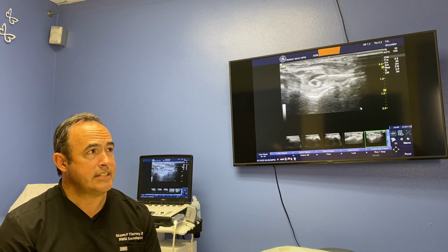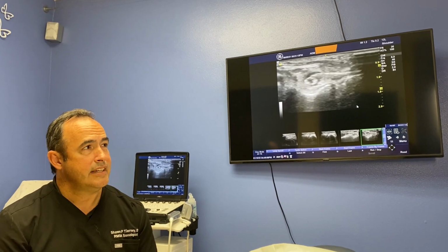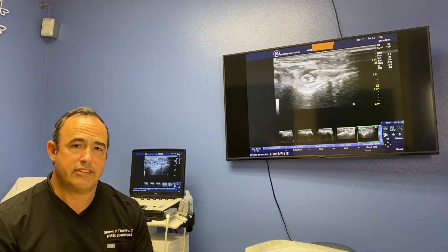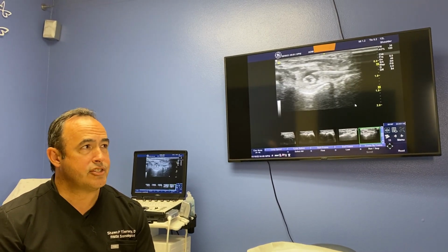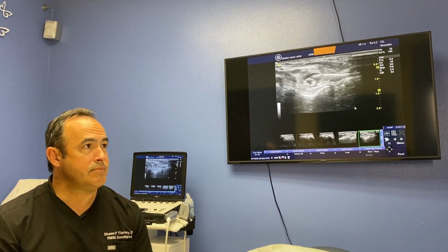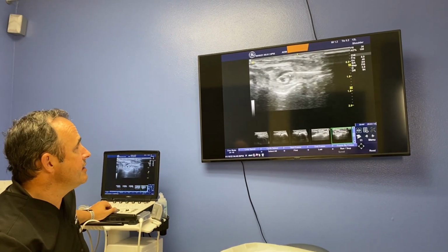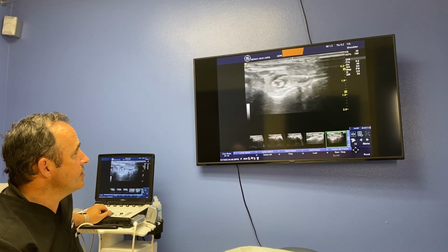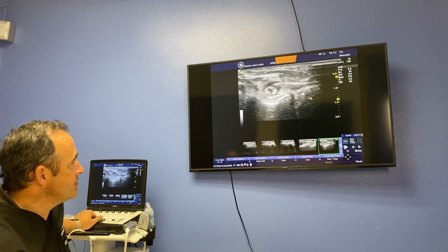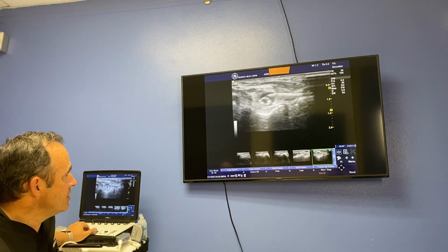So with hydrodissection we can use fluid rather than scalpel, directed very carefully with a small gauge needle to push the connective tissue off of the nerve. So we're making a structural change with an injection where we achieve more space on the nerve. You can see here on the screen this is a needle, a very small gauge needle. This screen, the full picture, is 2 centimeters, so it's a very enlarged image. You can see this needle coming, and it's right next to the nerve.